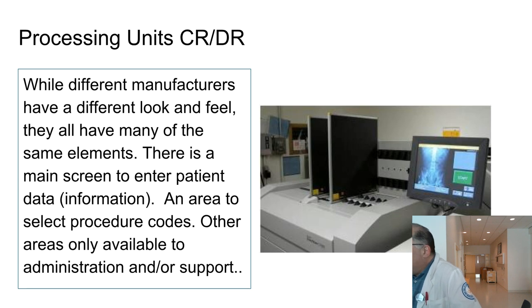So let's just start with stuff that you kind of already know, and now that you've been in clinic have probably seen. Everyone's using different CR plate readers. Anyone use anything that looks like this one here? This is a Kodak. They all basically have the same function internally, right? You'll learn about this in a week or two, when we have a lecture about CR-DR technology.